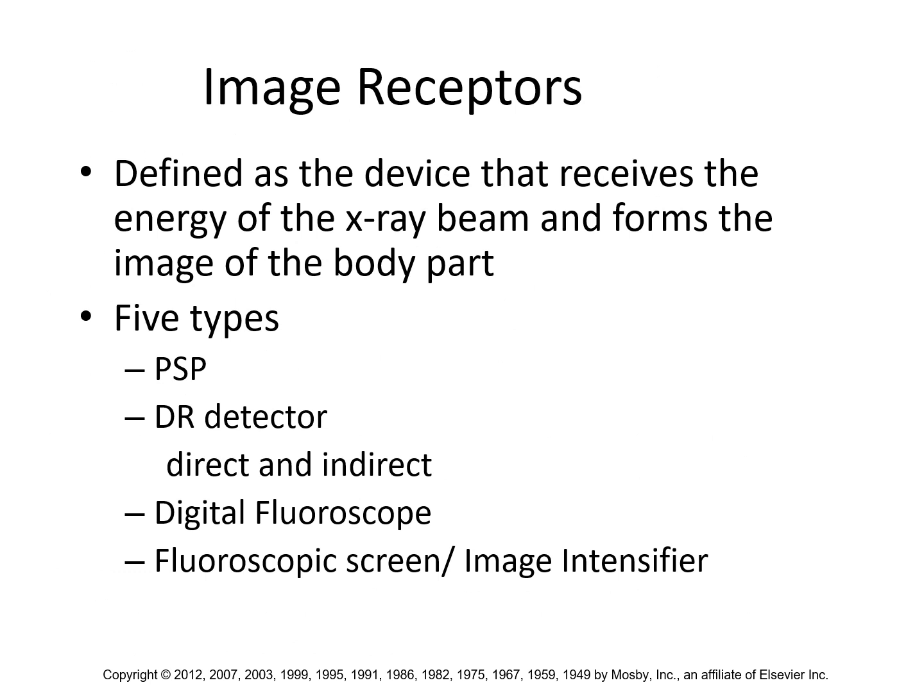All right, so our image receptors. There are 5 types of image receptors. I think the book still mentions screen film, but we're going to forget about screen film. Primarily in the modern imaging center or hospital, there's going to be CR technology, computed radiography, which is also your photostimulable phosphor. So the CR cassette, the PSP, photostimulable phosphor, that's the same type of technology.